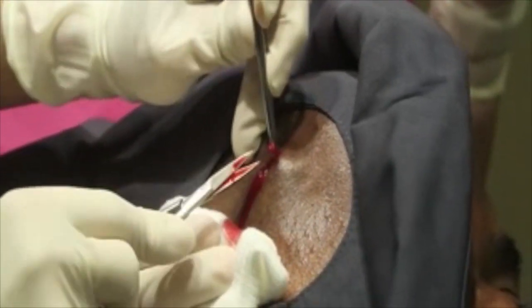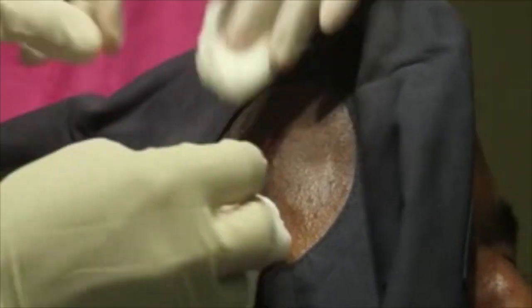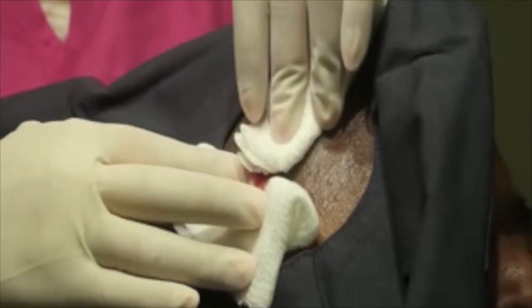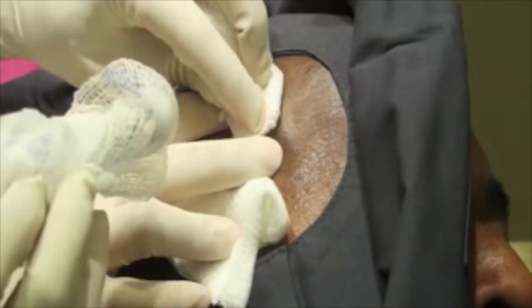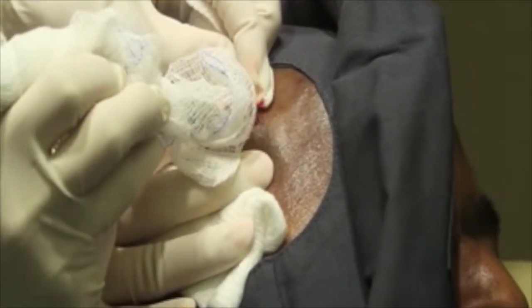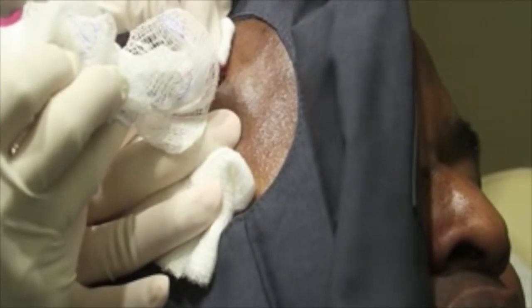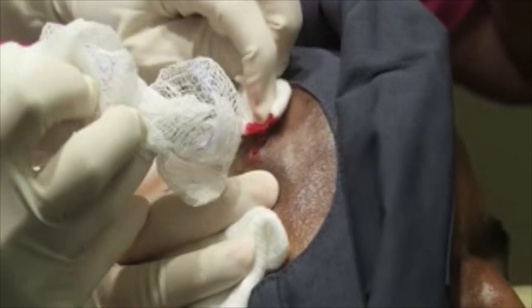I'm not making it easy for you to see, am I, Valerie? Okay. You sure? Let me see if I can push it a little bit. Oh, can you tap the top again? I see it under there. Can you pull the sides apart like that just now so I can buzz it again? Buzzing again, you're gonna hear. I don't think you can see, okay? Your fans are going to be so excited that you get this little thing removed.